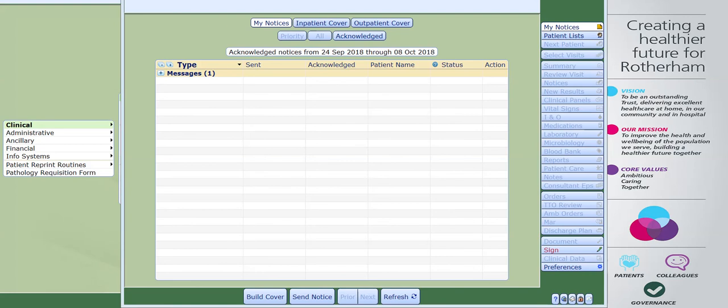For the purpose of this video we are focusing on inpatient cover within physician care manager. This is accessed via the my notices screen. Once you're in your my notices screen, you will get taken to this screen as soon as you log on to Meditech. Alternatively, if you are already in the system, clicking onto my notices on the right hand side will take you to the screen which is now visible on the video.